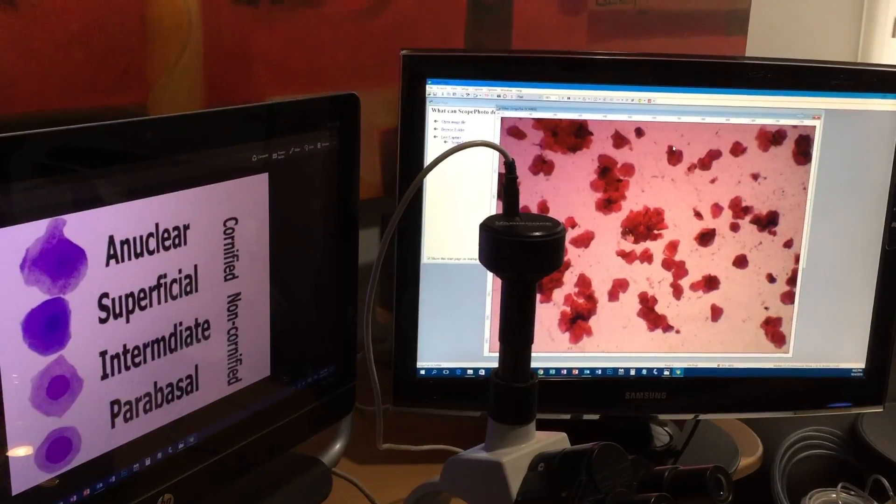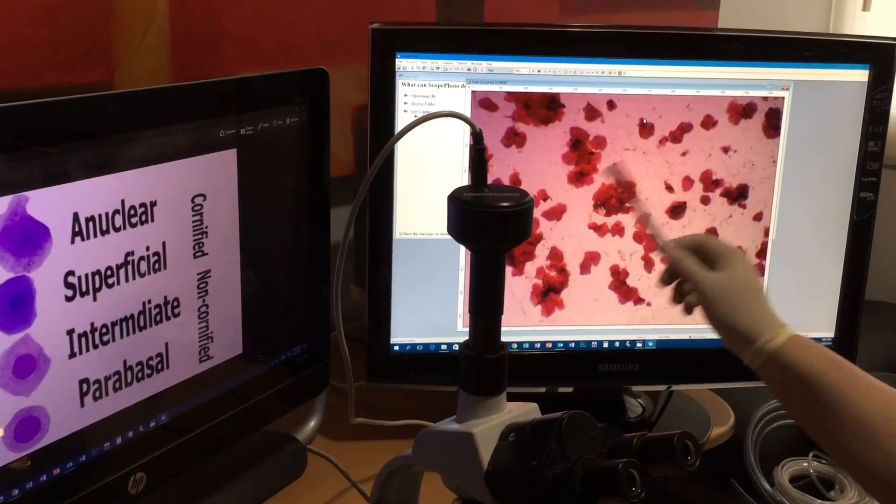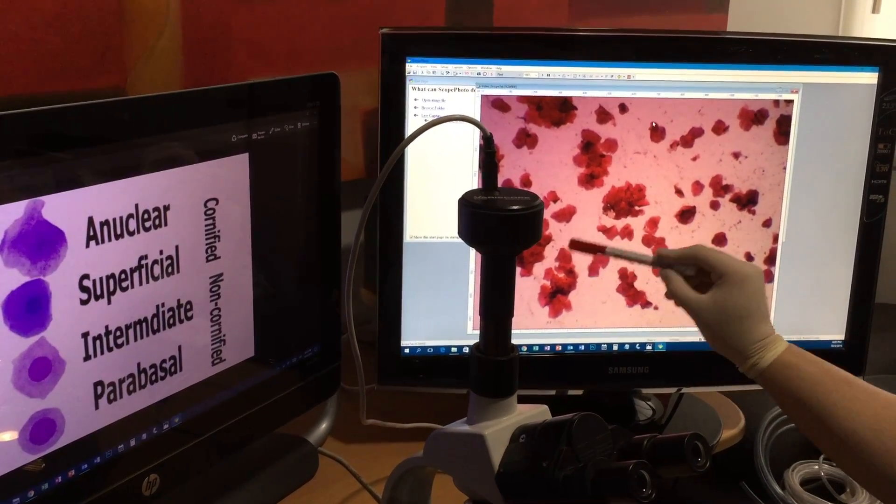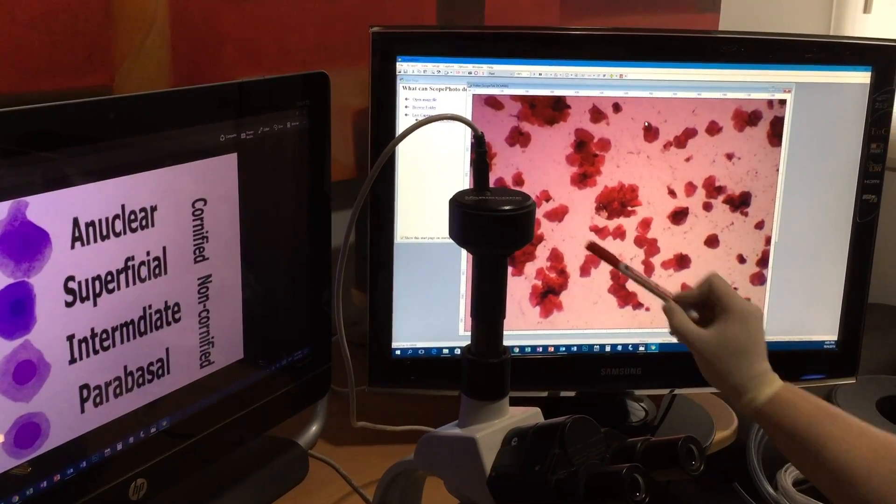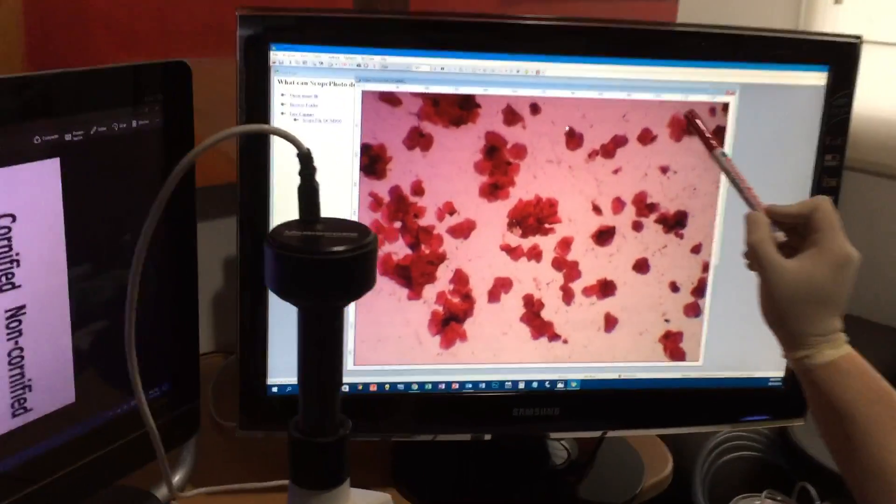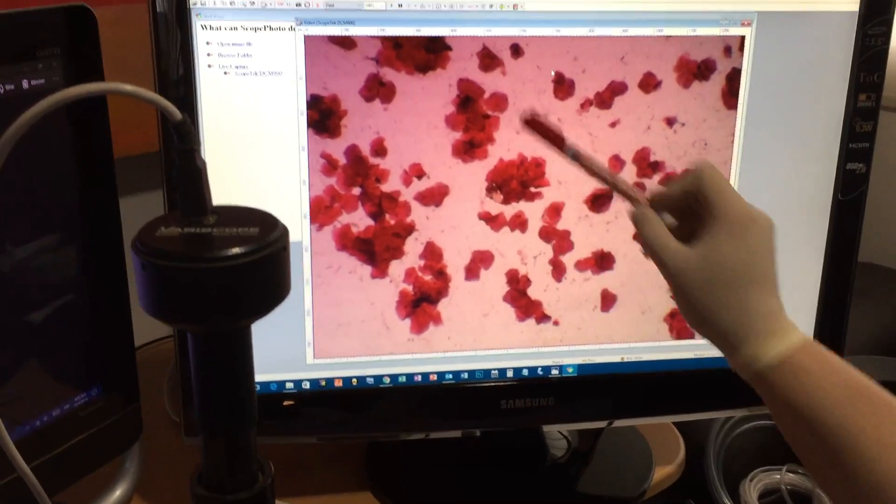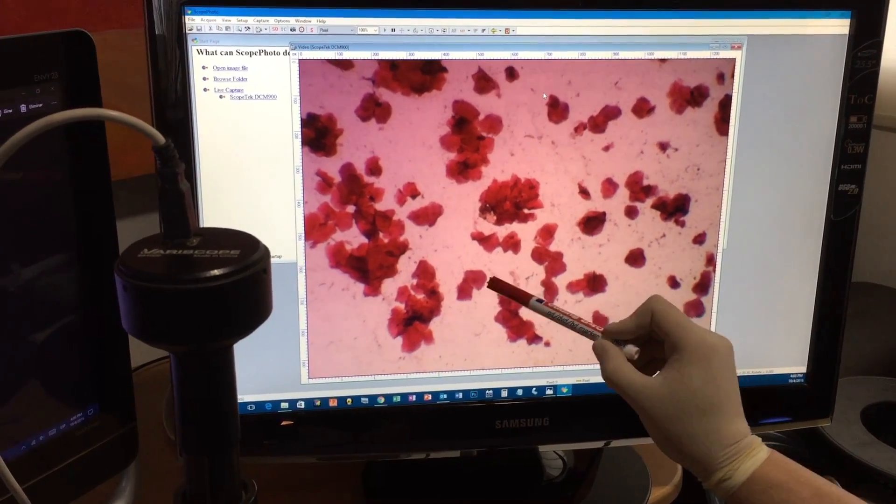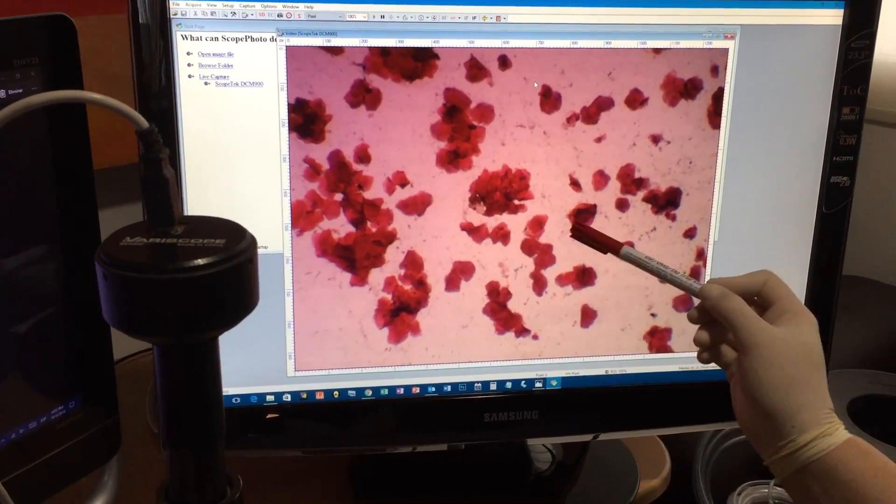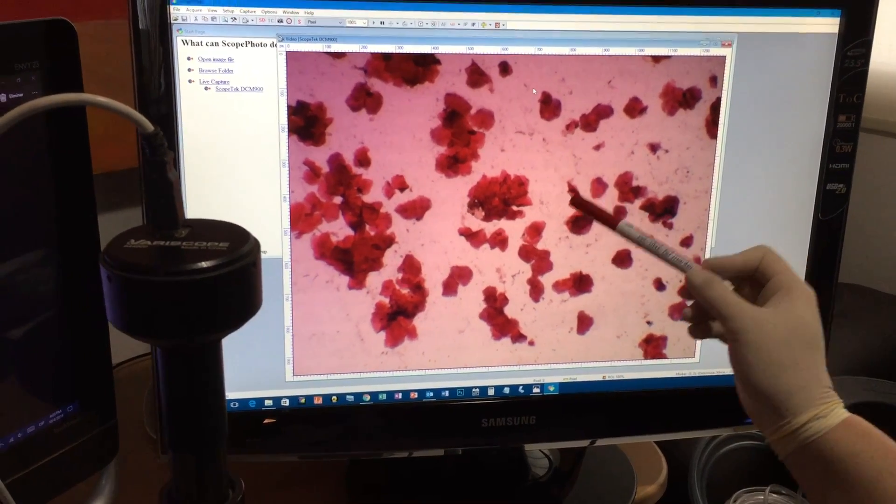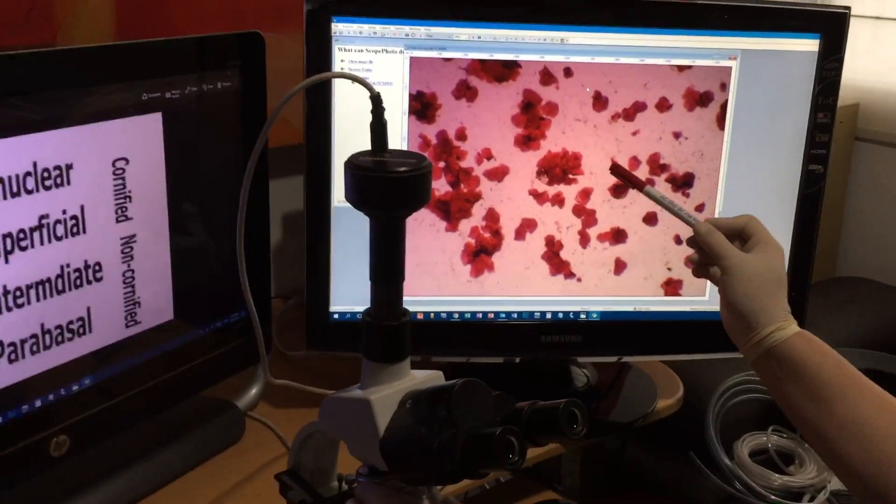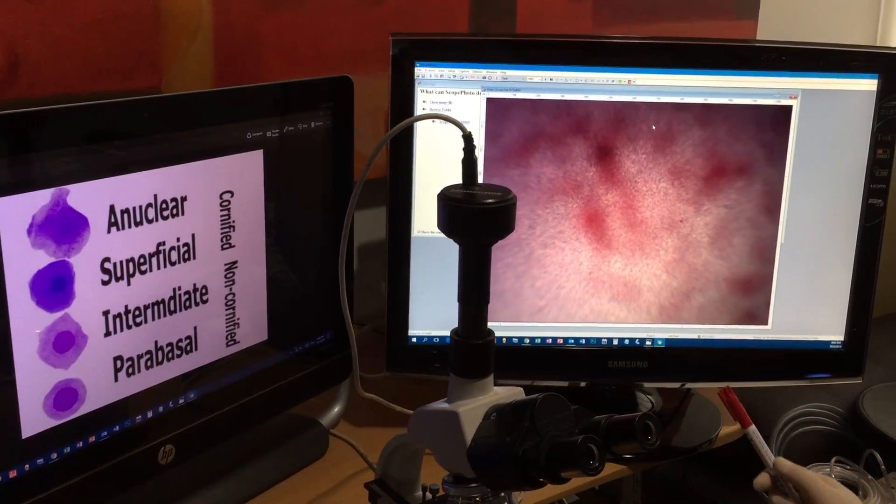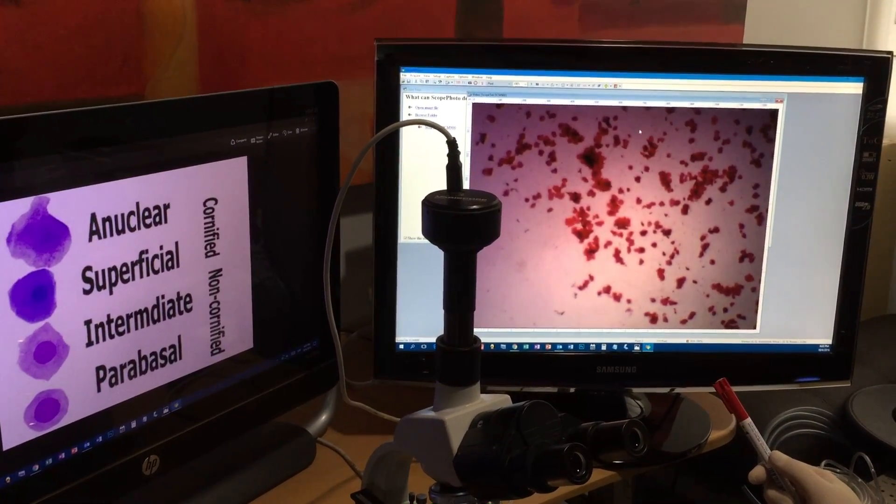So we have the slide here. As you guys can see, most of all these cells are already cornified, which means they don't have a nucleus inside. You can barely see them here. But most of them, what you want to look for, it looks like a Rice Krispie, like cereal, and without the nucleus inside. We're looking at it in 10x.